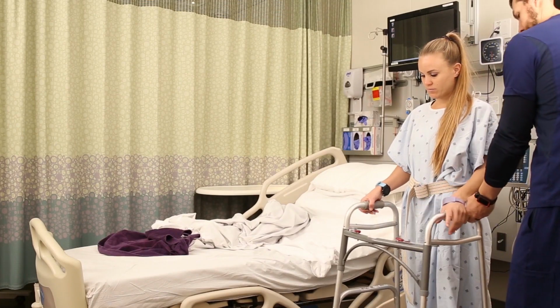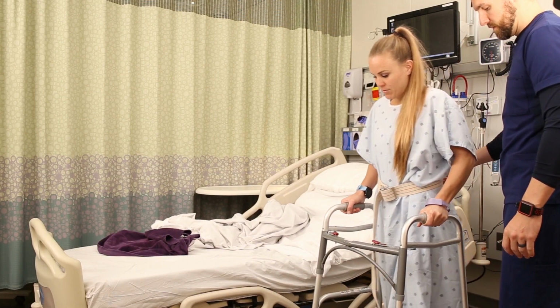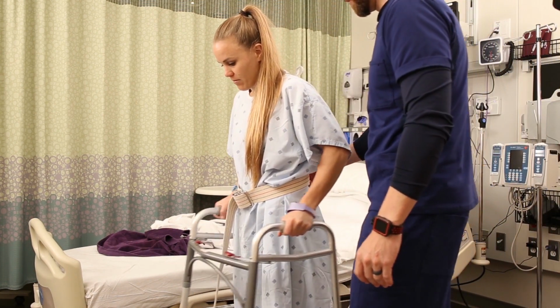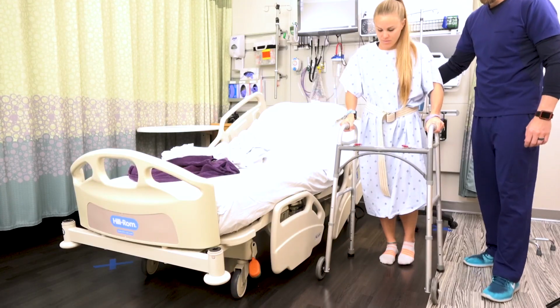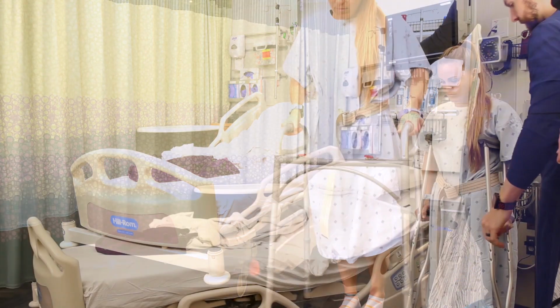Now let's say we want to use a walker. In this case, the same principle applies. Walker, bad leg, good leg. It's really important that they understand that they should be advancing their bad leg with the walker. Walker, bad leg, good leg.